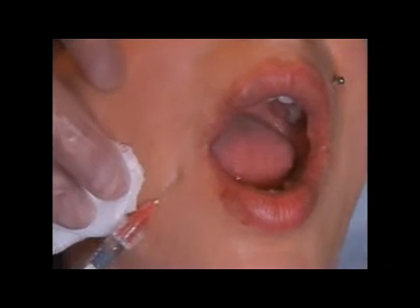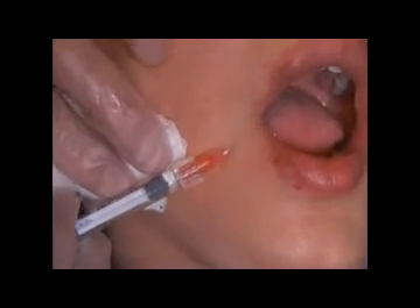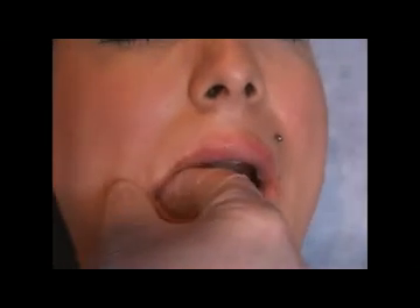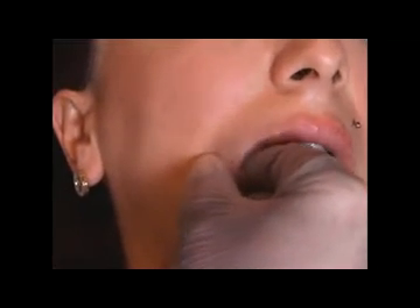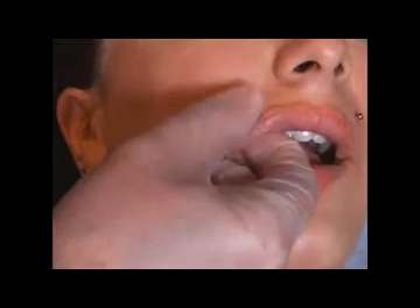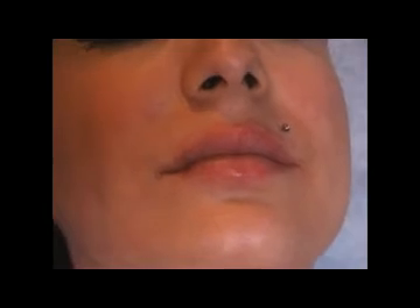You can make the augmentation of the angle — just make a fan here. Close, open a little bit, and massage directly after. This was all only one syringe. The swelling with this material is maximum ten percent, so you normally see what you get. I think it's nearly enough — I would not give more.